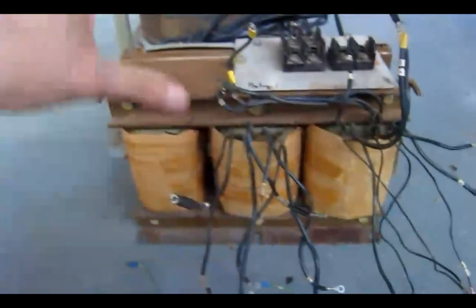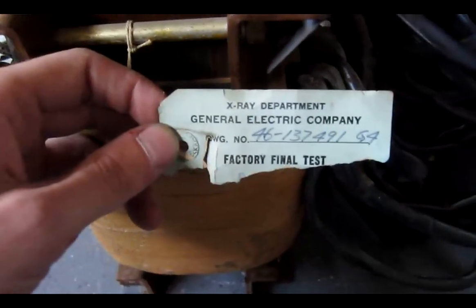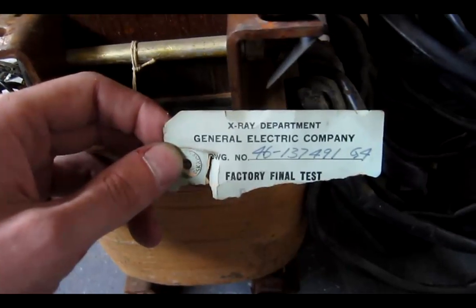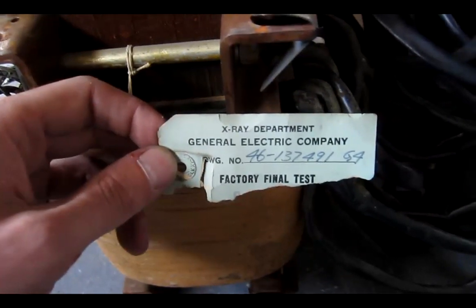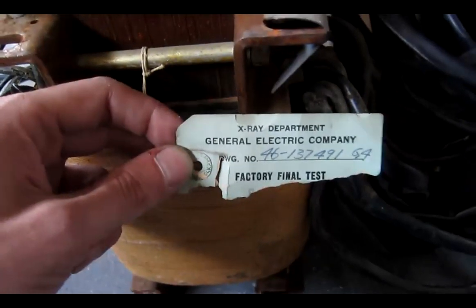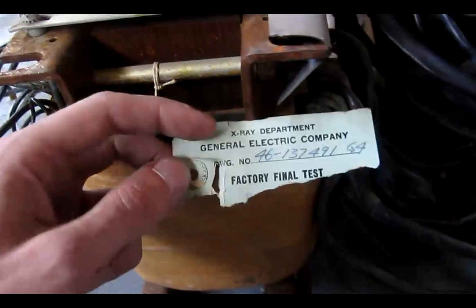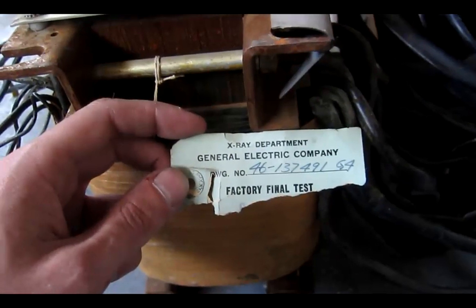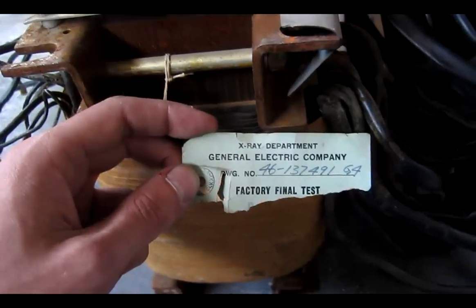I need to know exactly what this is and we have a clue. The clue we have is X-ray Department, General Electric Company, 46-137491 G4. Now that's your clue and it came from the factory. We know that this is from General Electric brand x-ray medical equipment.